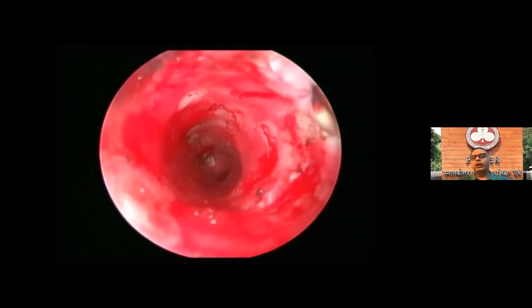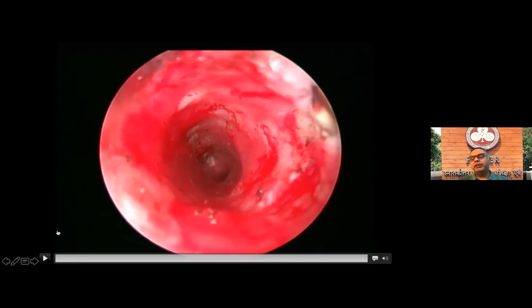So this is how it looked after we were done with the trachea. This is an edited video. It must have taken me a few hours of struggling, cleaning. This was also at our initial stage when we were still in the learning curve of using this tool, and we were using the older EVAC 70 wand, which has a tendency to get blocked frequently.